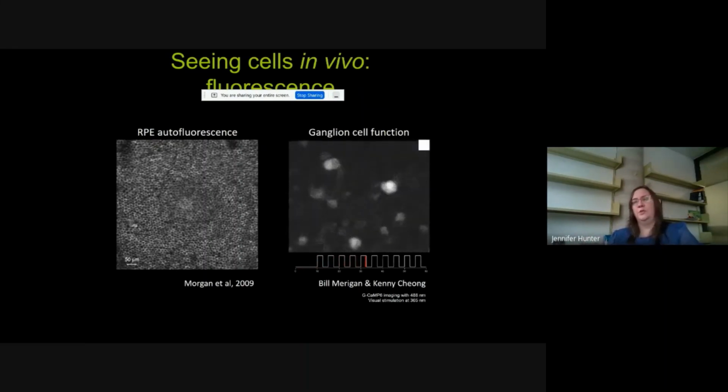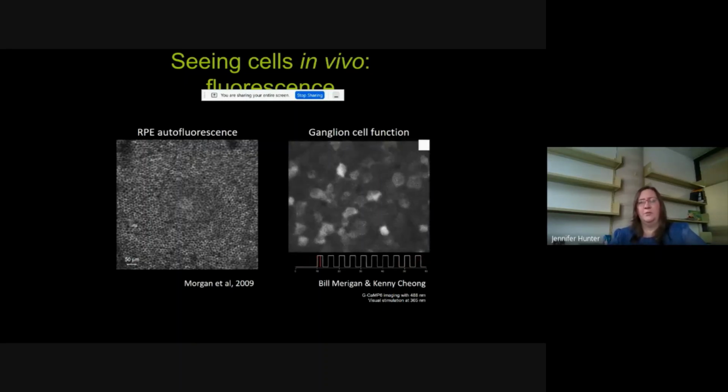And so fluorescence imaging, very common with microscopy. So fluorescence imaging has been a major push of my research, and is sort of a lot of what's being done to try to understand function of the retina beyond the blood flow and the immune cell work.